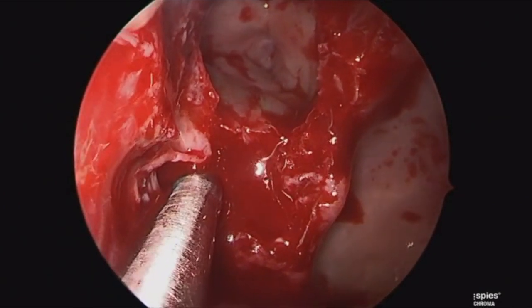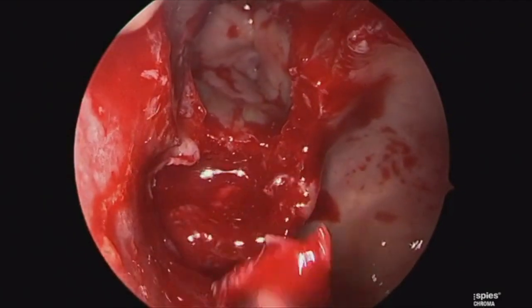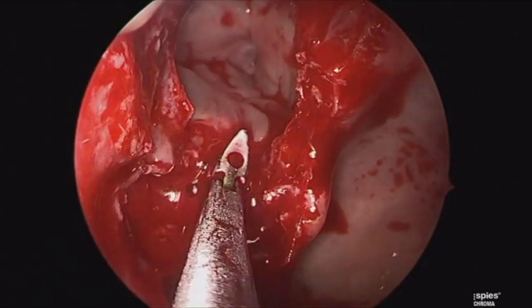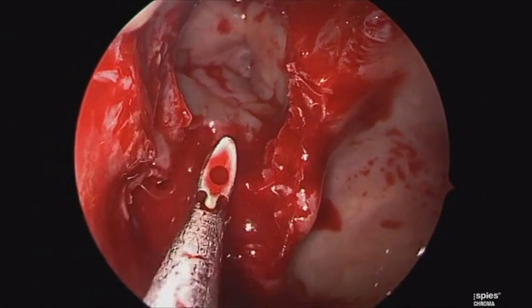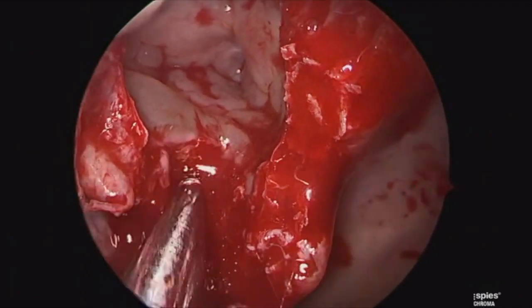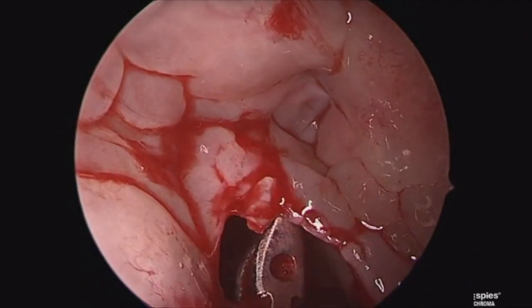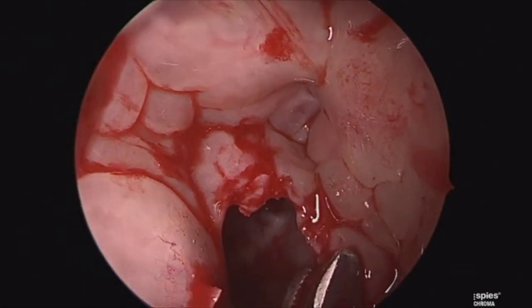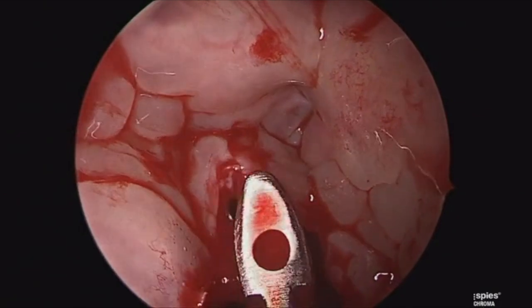As you can see in this case, there is an Onodi cell of that posterior ethmoid cell above it. So we will work to bring the floor of that Onodi cell and continue the sphenoid sinus opening to maximize that sphenoid sinus opening. Here we are with a pediatric 45-degree throughcut, taking that floor of that Onodi cell — or roof of the sphenoid — back further in order to maximize that opening and bring the skull base in continuity from the sphenoid into the posterior ethmoids. If you feel behind it in a closed fashion, you can tell the depth of that partition in order to take a thorough bite across it. You can also see a nice optic canal recess within that sphenoid sinus just posterior to where we're working now.